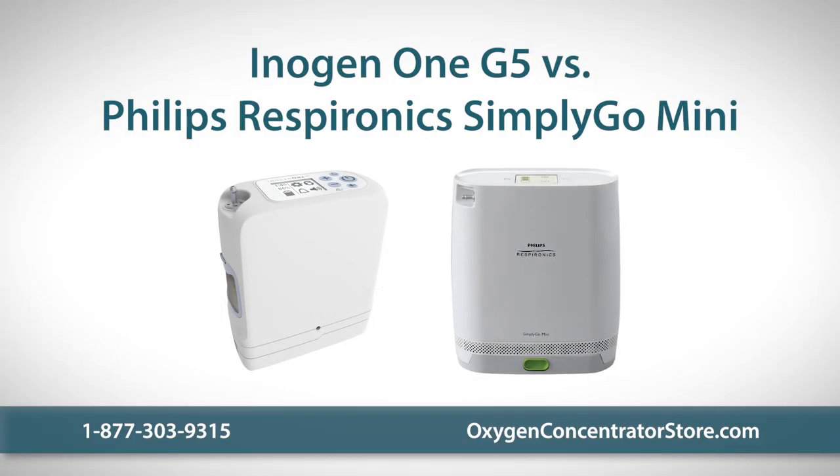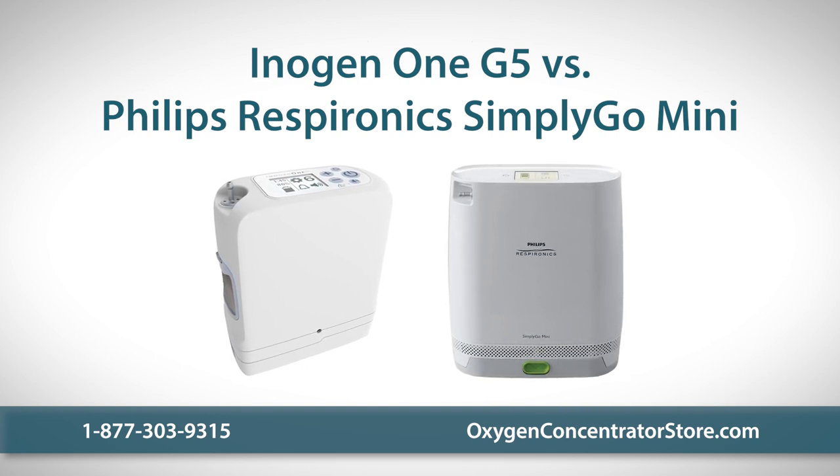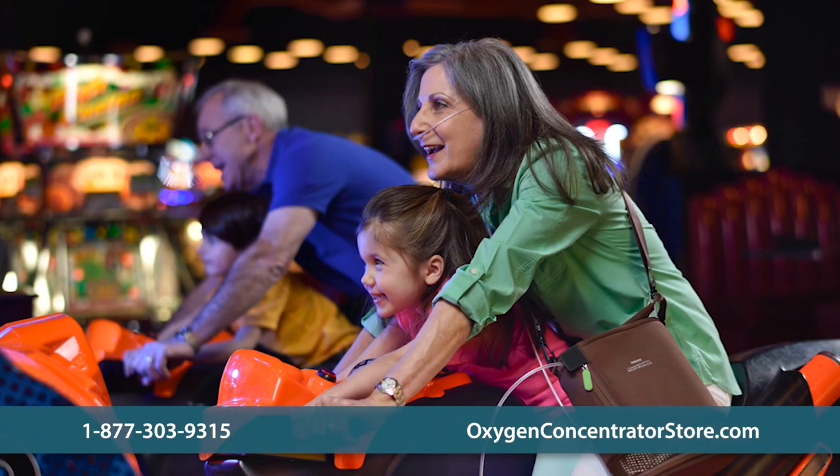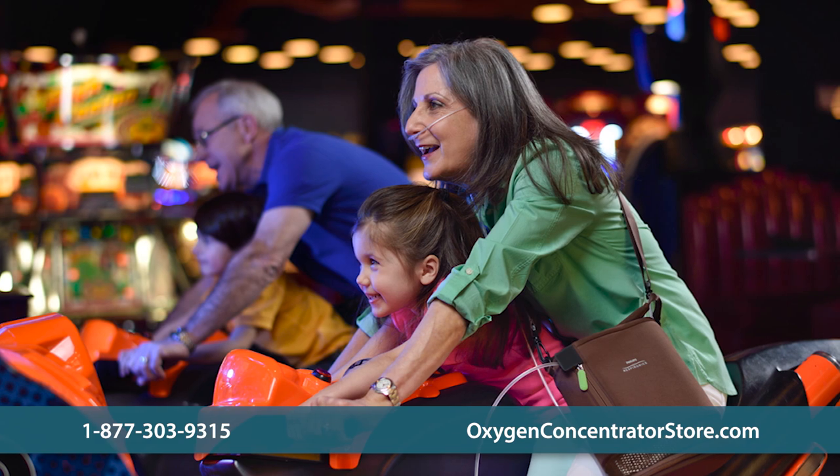The Inogen 1 G5 and the Philips Respironics Simply Go Mini are two excellent portable oxygen concentrators to choose from. Keep watching to learn more and compare so you can decide which one is right for you.